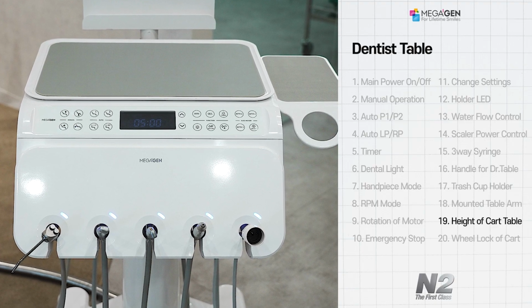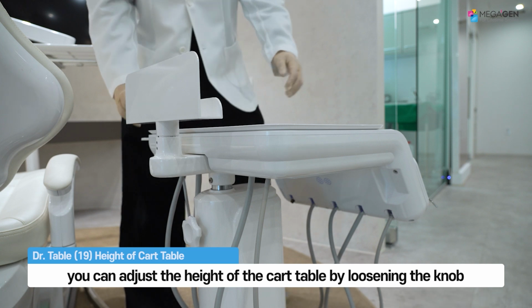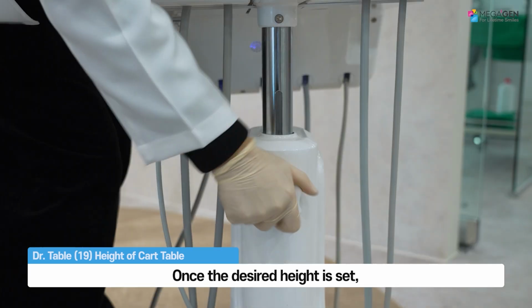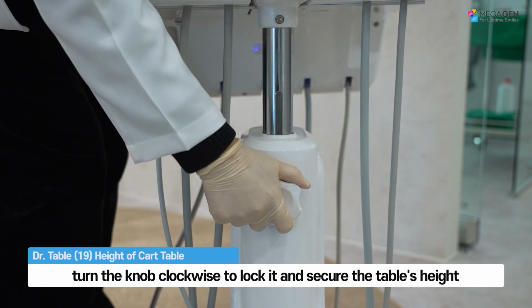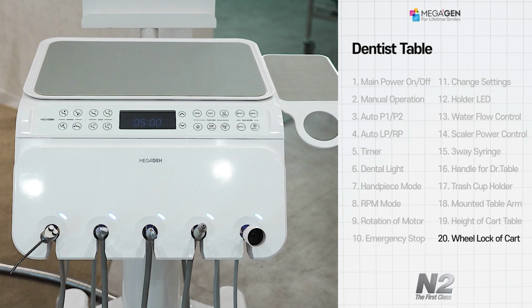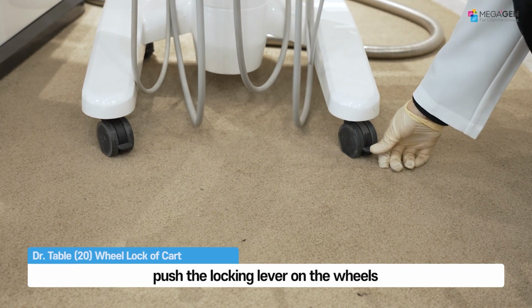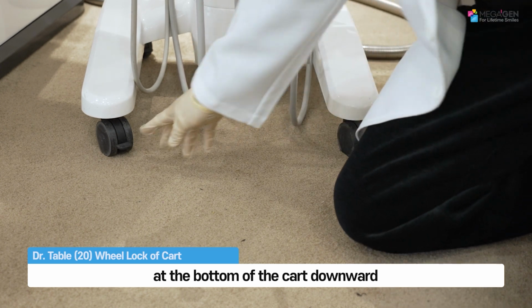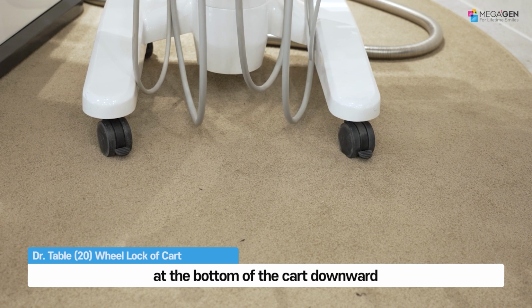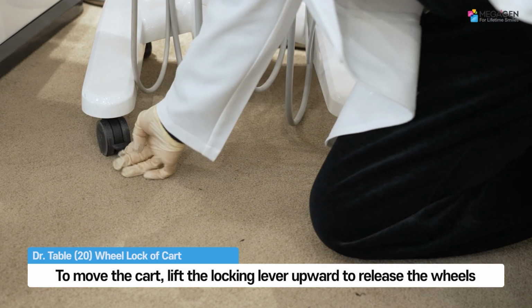Cart table height adjustment. Similar to the mount table, you can adjust the height of the cart table by loosening the knob. Once the desired height is set, turn the knob clockwise to lock it and secure the table's height. How to lock the cart wheels. To prevent the cart from moving during treatment, push the locking lever on the wheels at the bottom of the cart downward. To move the cart, lift the locking lever upward to release the wheels.